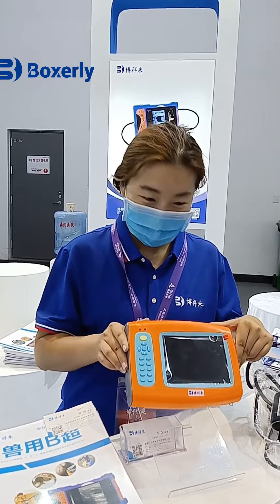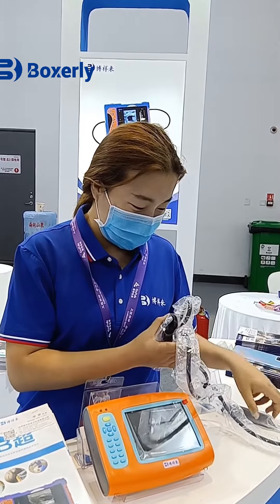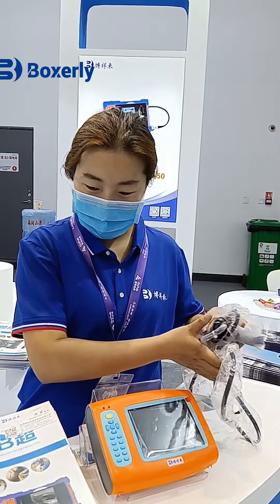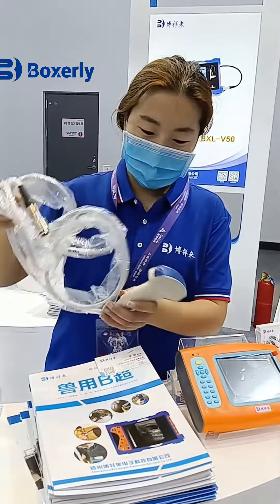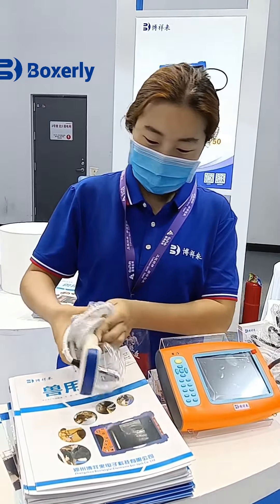First, let me introduce our first machine, BXLV10. This machine is our basic equipment. It can be equipped with two kinds of probes: a rectal probe and a convex probe. It is light and very portable. It is suitable for friends who only want to test the pregnancy of animals.